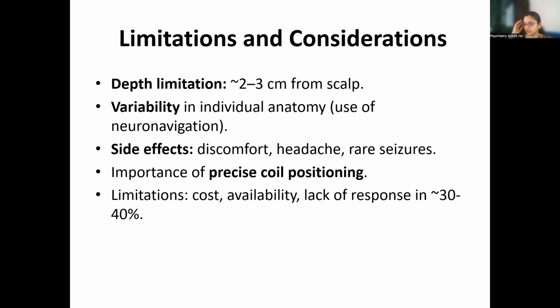Because of the stimulation, there is a direct stimulation of the temporal muscles, and that stimulation is the reason why patients often have discomfort and headache. So usually, if it is mild, we gently reassure them, and mostly these effects go away with time. But if it is very bothersome, then we might have to abort the therapy. There is very much importance of precise coil positioning. So with an approximation and with individual variability, we might actually be missing out the real therapeutic areas.